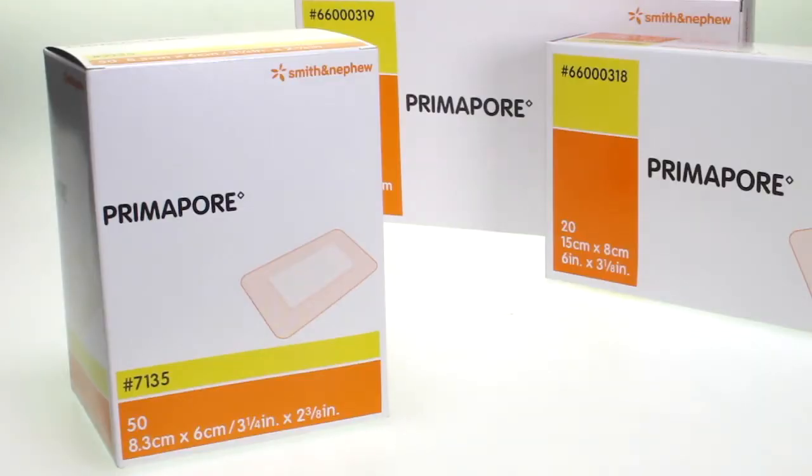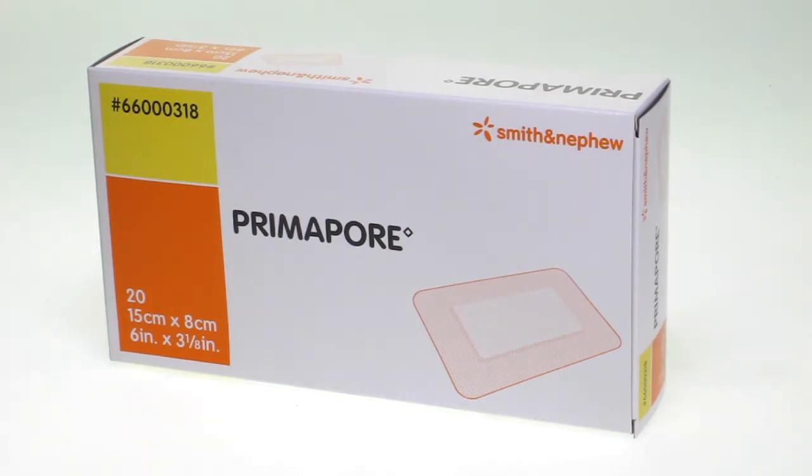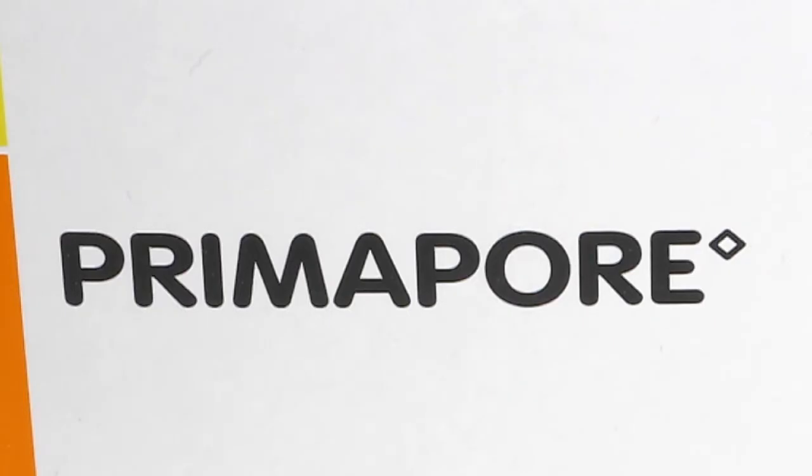They are available in four sizes including 8.3 x 6cm, 15 x 8cm, 20 x 10cm and a 25 x 10cm.